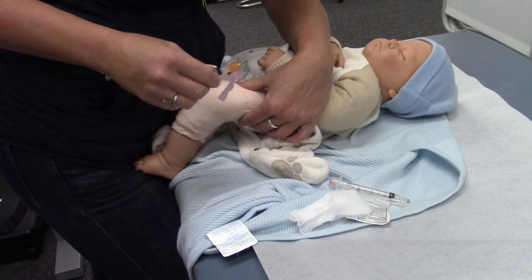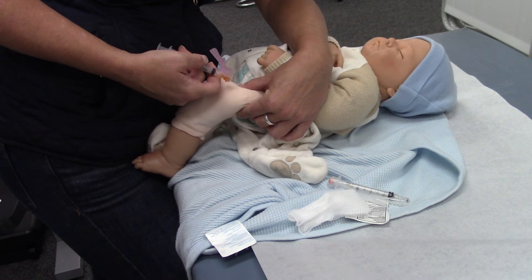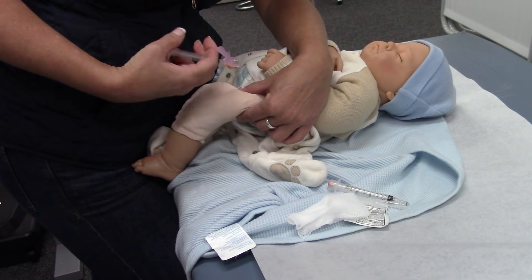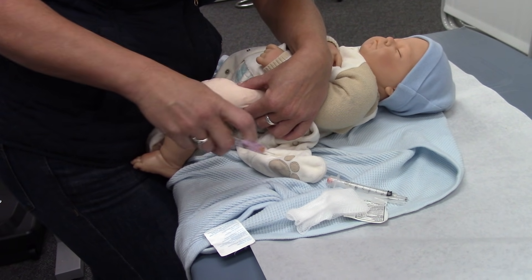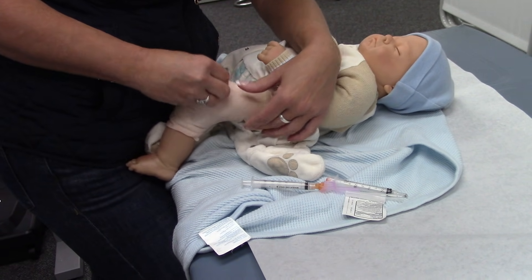Five-eighths inch needle, bevel up. Just go in like this. Inject. Out. Safety. Ta-da!